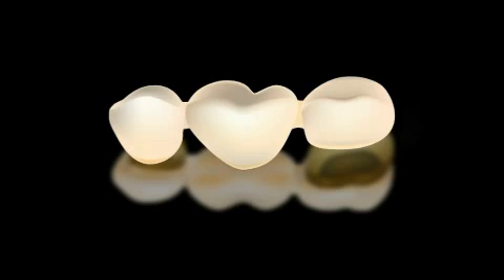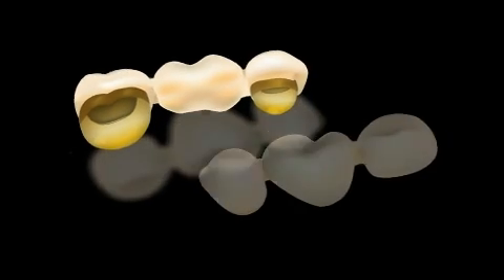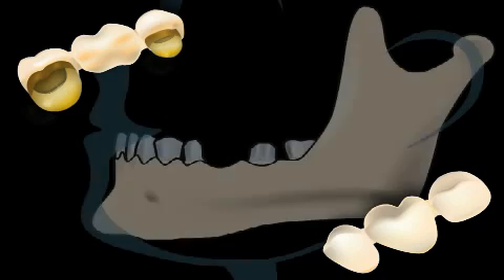Bridge is the dental jargon term for a fixed dental prosthesis in which at least two teeth are fitted with a crown and then connected with one or two links.